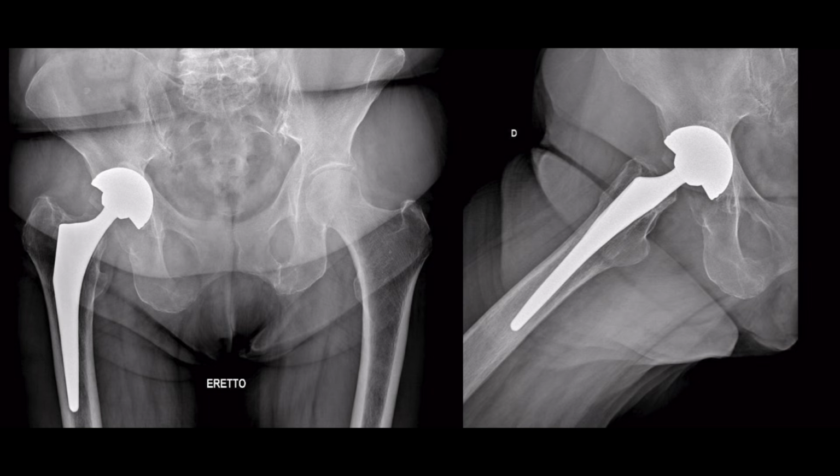The image I'm presenting now compares an artificial hip on your left side with a completely normal hip on your right side. The first thing you'll notice on the two X-rays is that the hip prosthesis is inserted between the bony surfaces. Shortly, I'll explain how this is possible.